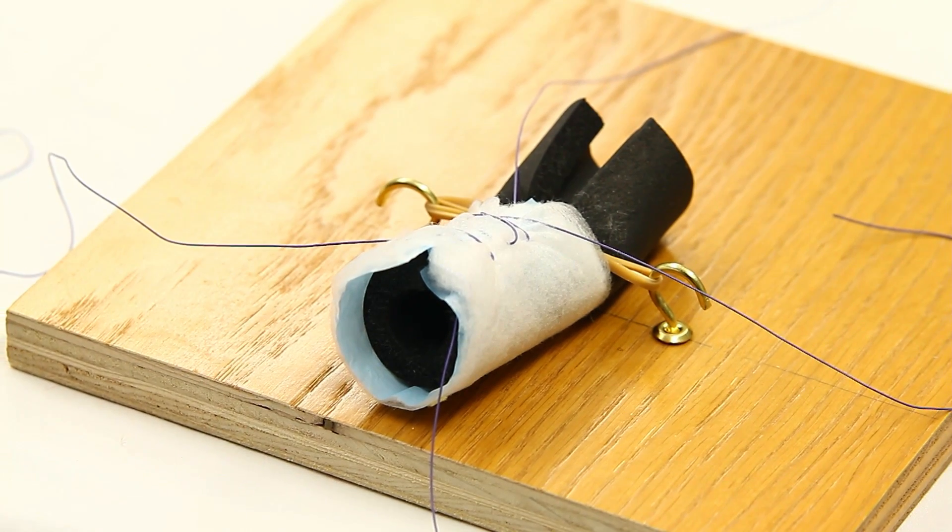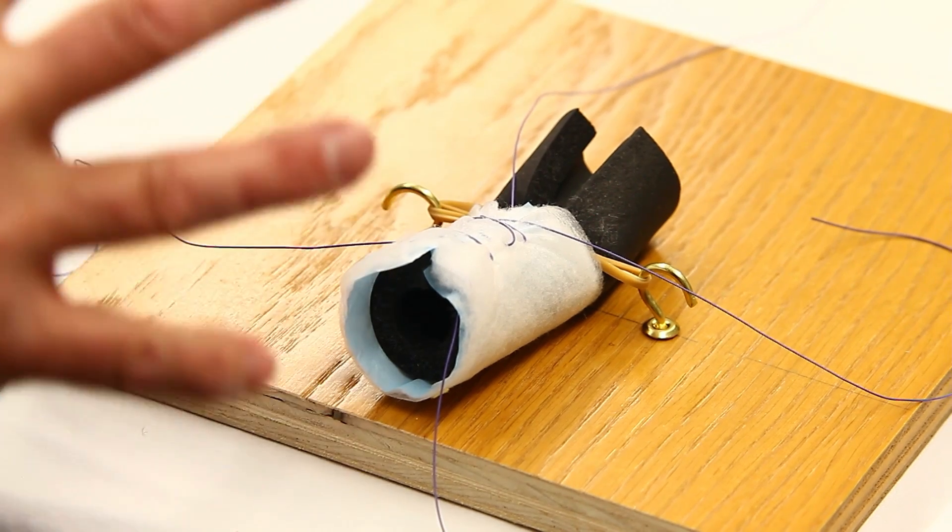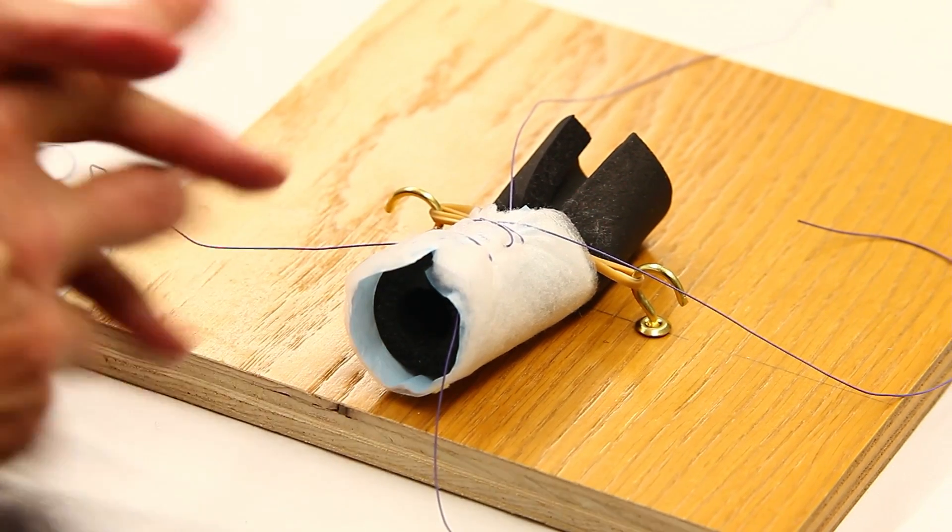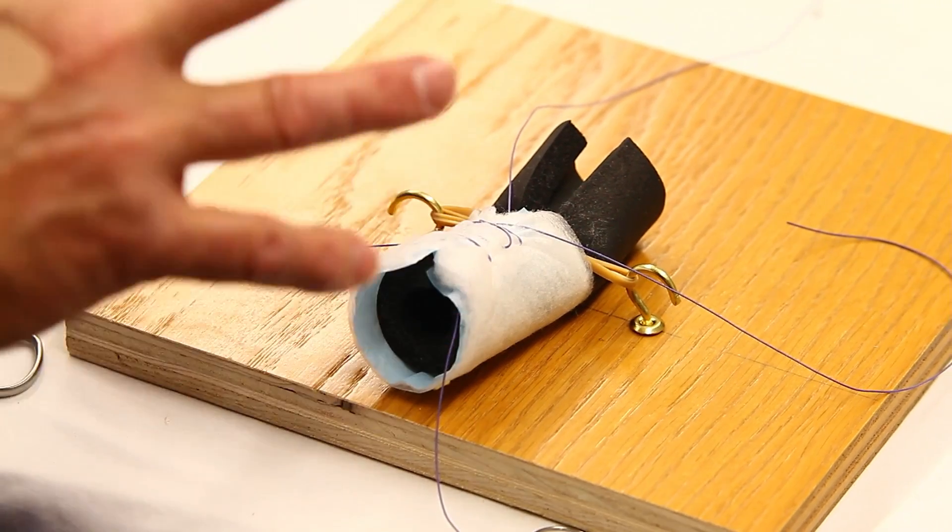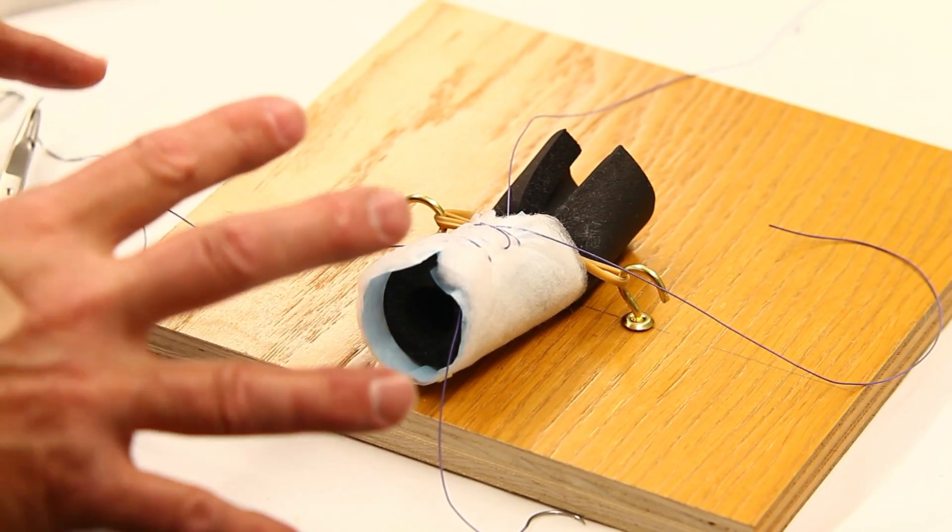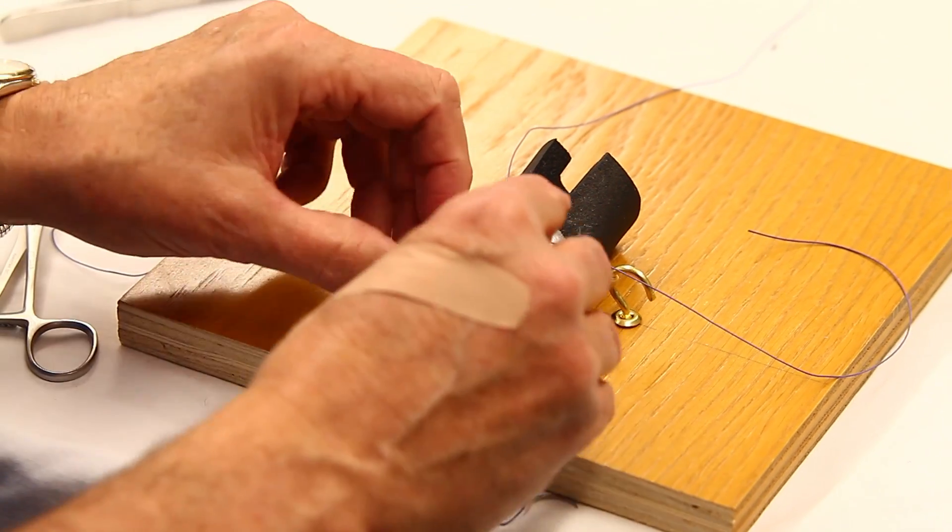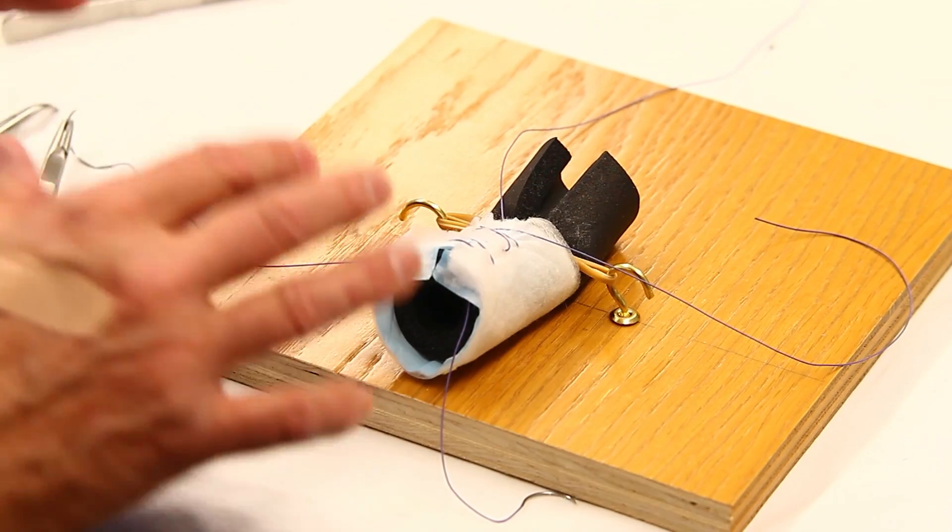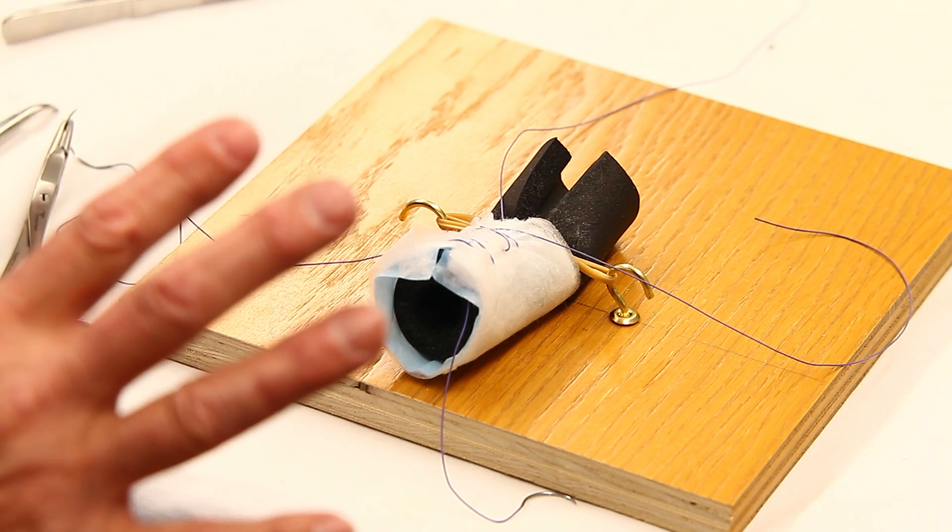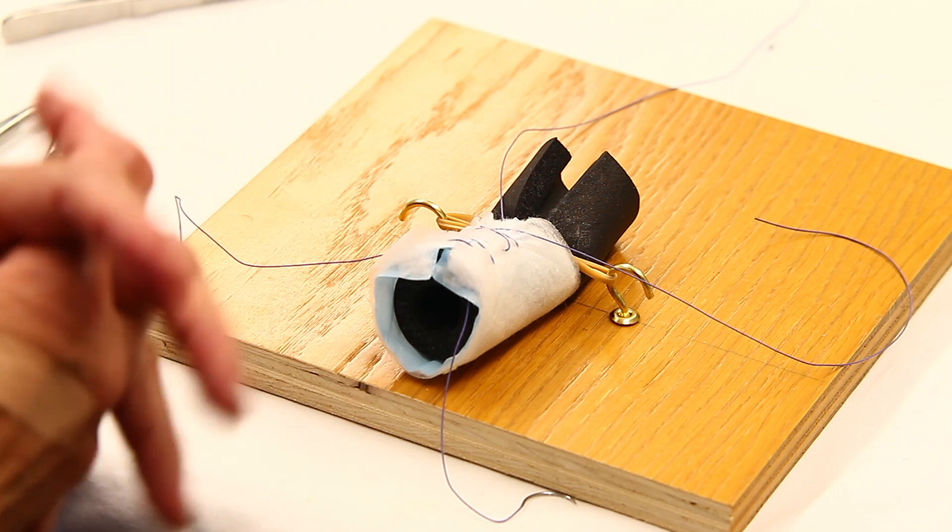Again, this is really not the perfect simulator, but it gives you a chance to practice delicate suturing. Remember that the needle should be tapered. We've used CT1s and CT2s. The CT2s have a little smaller curve and fit inside small spaces better, like the foam pipe fitting. The rest of it we used CT1s. CT1s on typically 3-0 Vicryl would work fine for almost everything we've done.